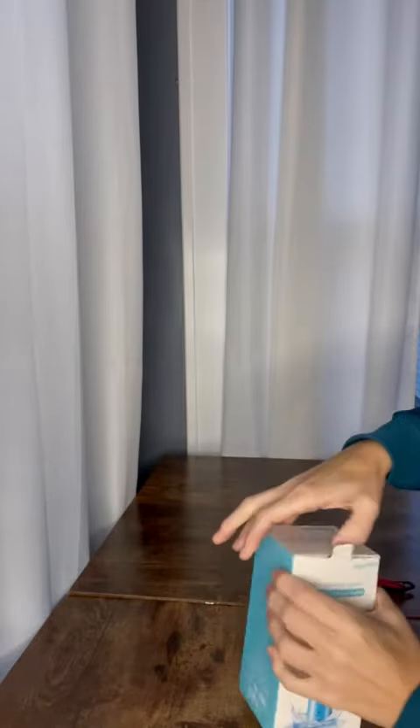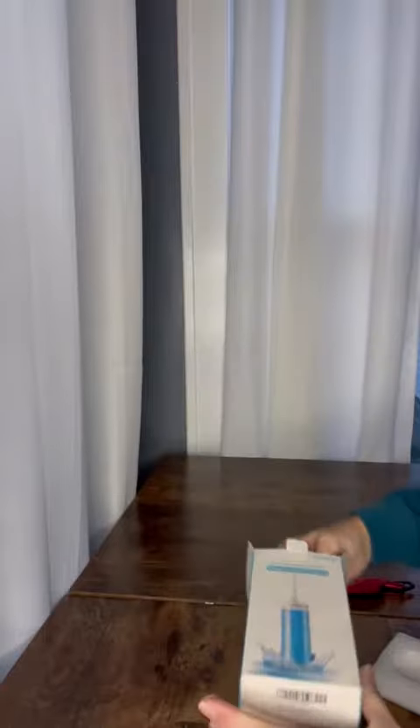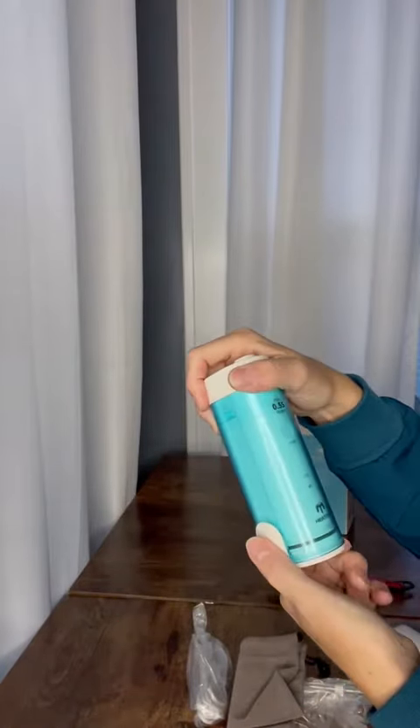As I said, flossing your teeth with braces is not possible with the strings, but with this oral irrigator it'll definitely get that stuff out from between the teeth. It's a very compact unit, very nice, and it's blue.